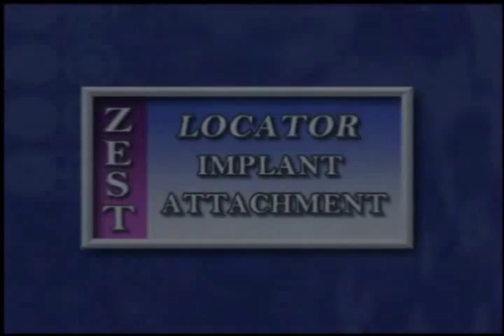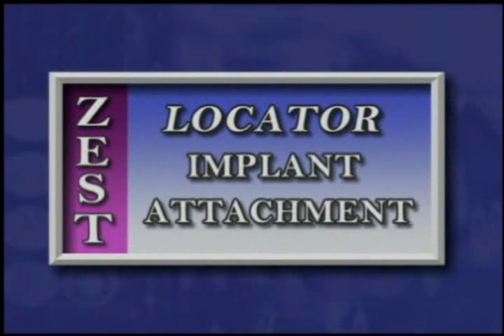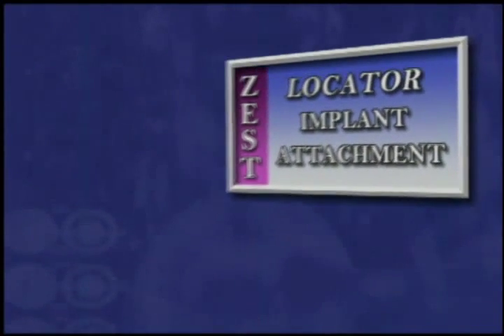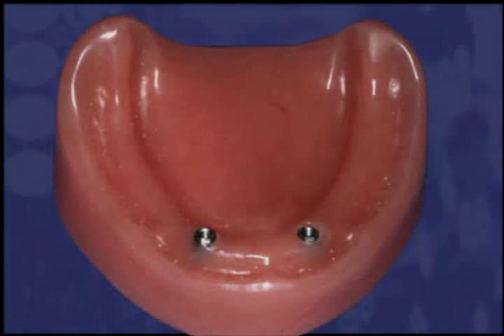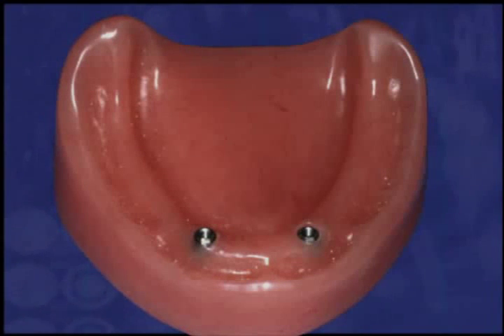The following step-by-step procedures and clinical case were photographed and provided courtesy of Dr. Alan Schneider from his private practice in Springfield, Virginia. This acrylic mandibular model is used to demonstrate the restoration of two externally hexed implants that have been placed in an elevated location at the same level as the surrounding gingiva.